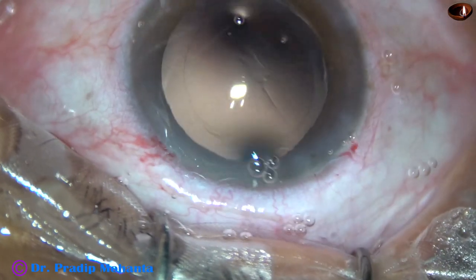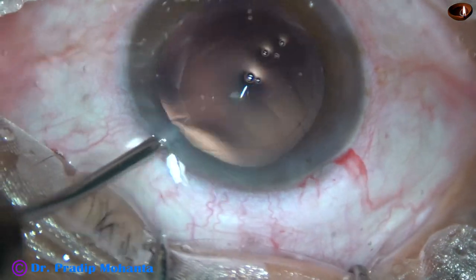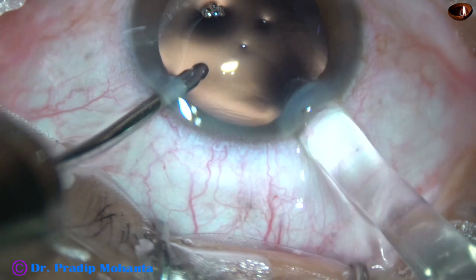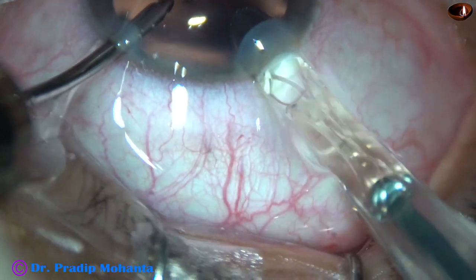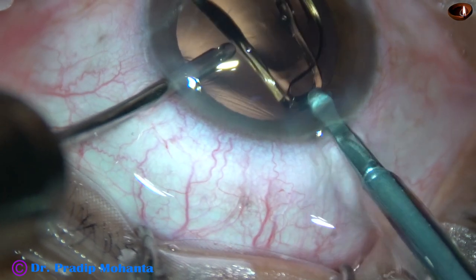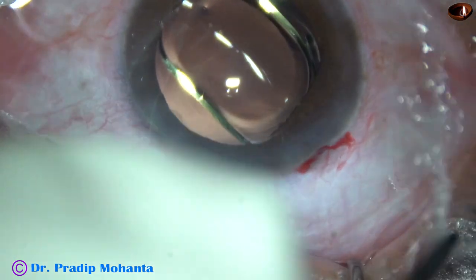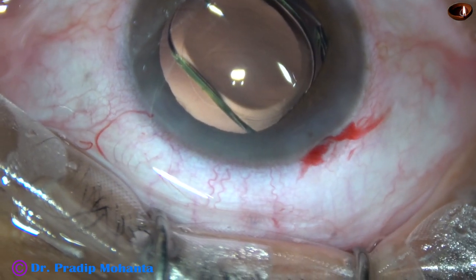Once this is done, we are ready for implantation of an intraocular lens. This is hydro-implantation of a single-piece monofocal intraocular lens. The lens has been placed in the capsular bag.